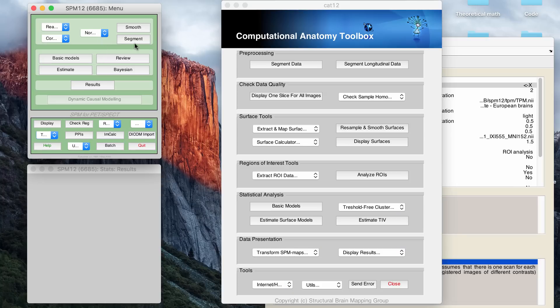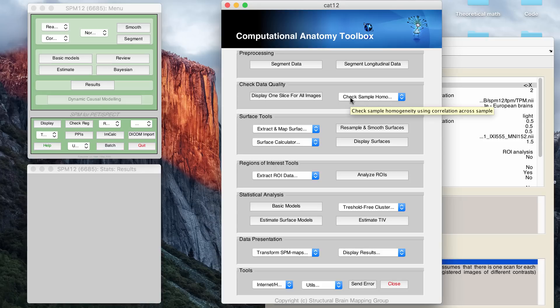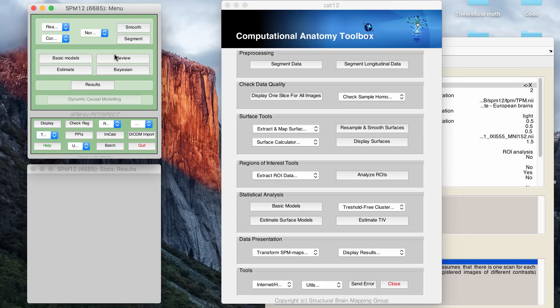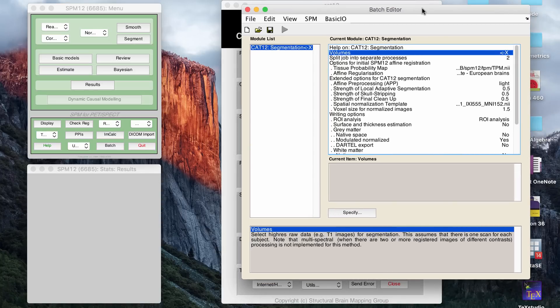So I don't use the segment button in SPM, I use the one from CAT12. In this tutorial, you have to go back and forth. So some buttons, you do use the CAT12 version, but you do still use some buttons from the SPM12 GUI, so don't close this because you're going to use both.